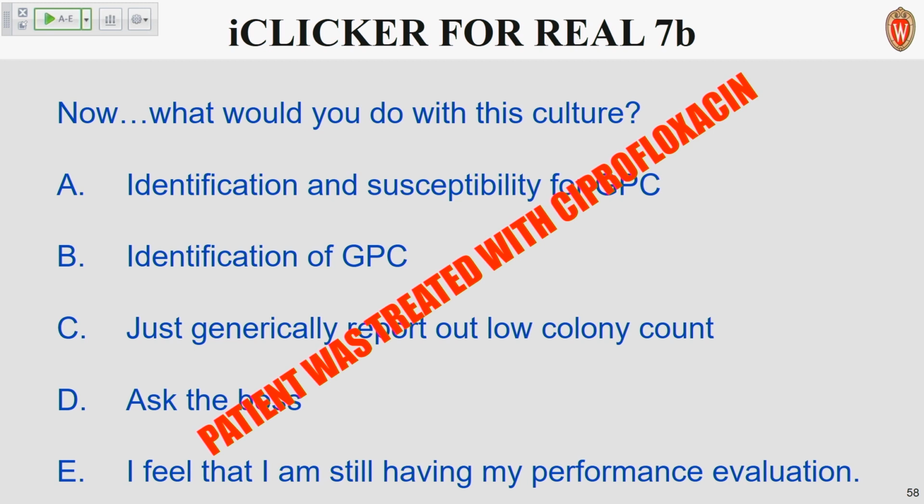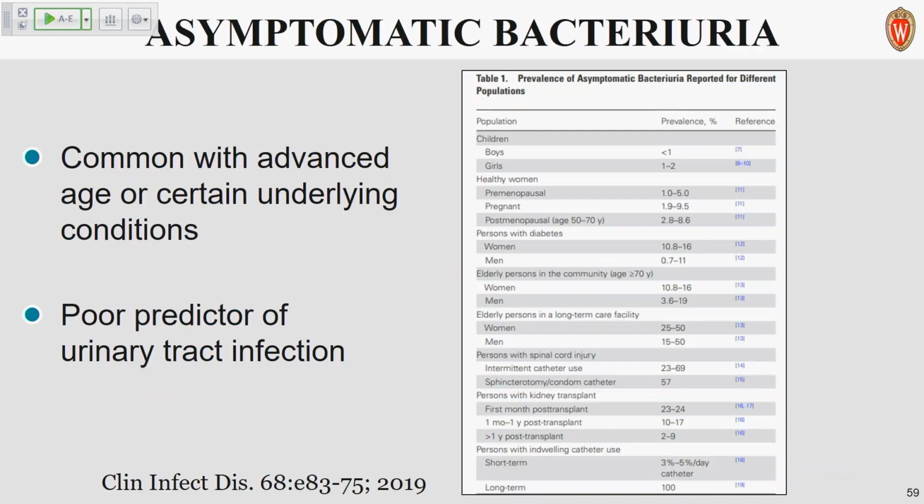Yeah. Anybody want to comment on that? Do we have that situation in other laboratory locations? Being advised by pharmacy not to work up a pure culture of coag negative staph. I think they may be going after what we're going to talk about in a little bit, perhaps. Yeah, when I train people, I tell them that older men usually have that, so we have to work it up.